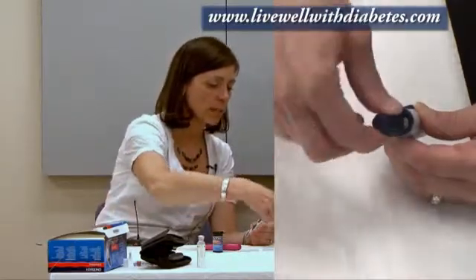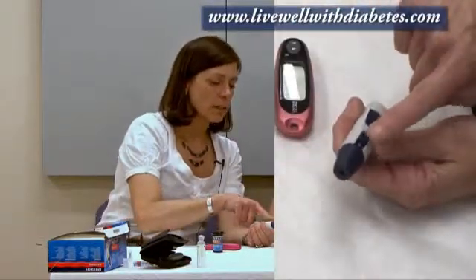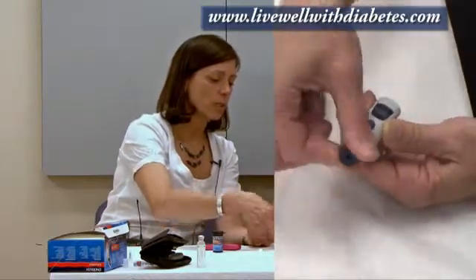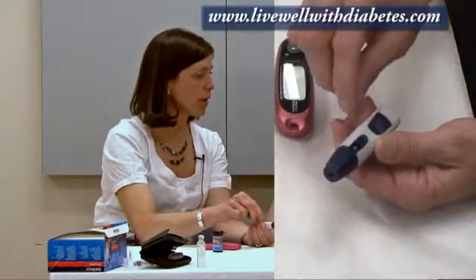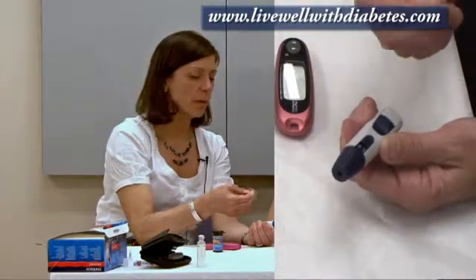I now replace the cap back over top. This number can change by turning this dial, and what this number does is change how hard the needle will poke you. The reason they have that is because everybody's skin is slightly different — some people have very thick skin, some people have very thin skin. So to make it as comfortable as possible, you can change this setting. It's not supposed to be torture; it's supposed to get just enough blood to run the blood test.